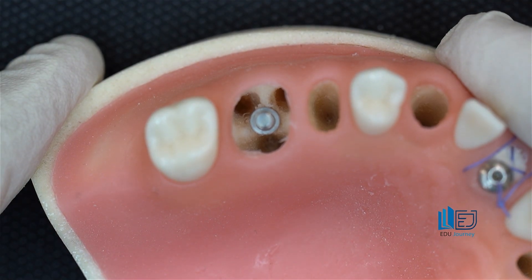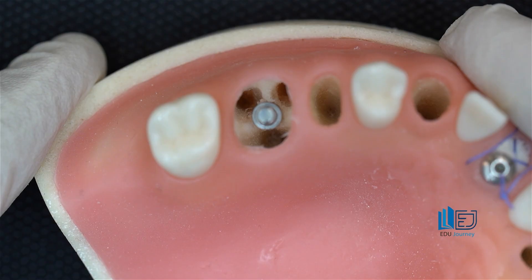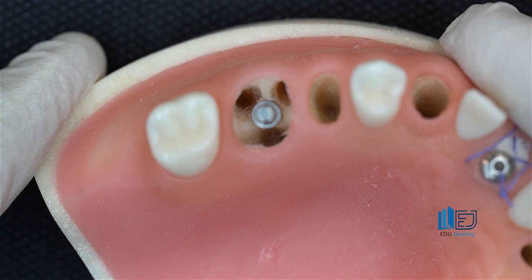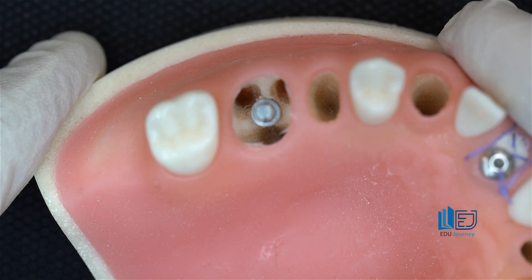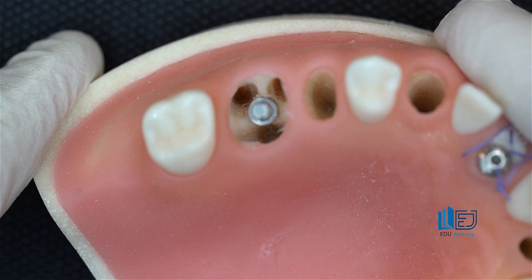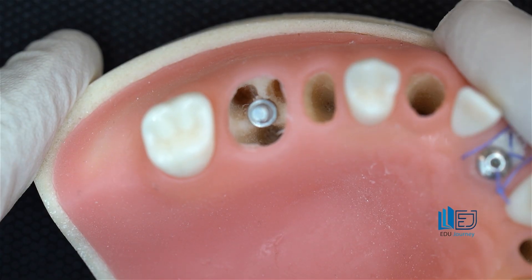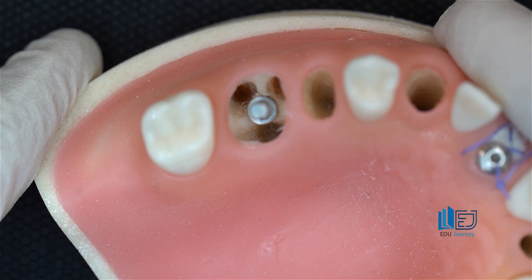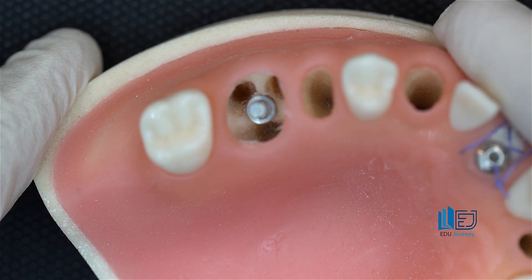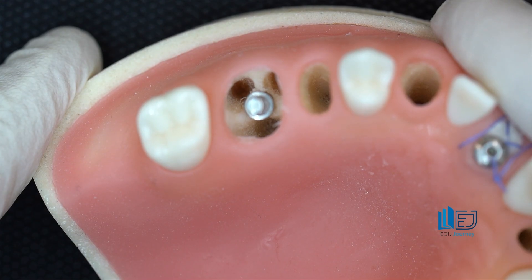For the upper molar, the distance between the apex of the extracted tooth and the floor of the sinus — the amount of remaining bone — determines whether you can achieve stability and perform fresh socket implantation. If this bone is sufficient, it's a good case. If the distance is small and roots are inside the sinus, it's not ideal — a sinus lift may be needed and stability is difficult. Similarly for lower molars, the distance from the apex to the nerve canal determines suitability. If there are three or four millimeters of bone between the tooth apex and the nerve, you can get anchorage and primary stability. If the distance is very small, it's not a good case for fresh socket implantation.